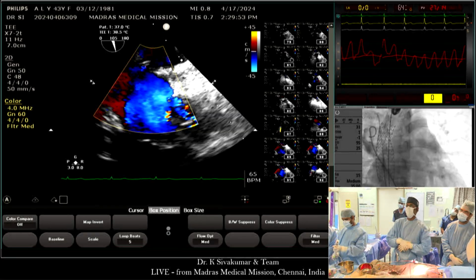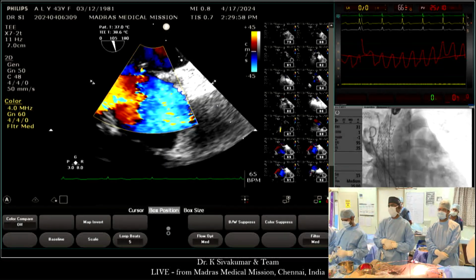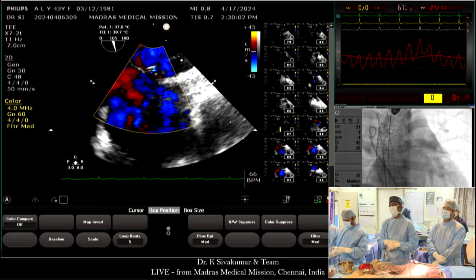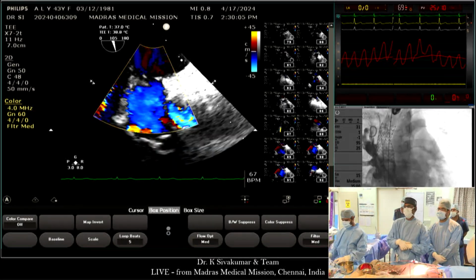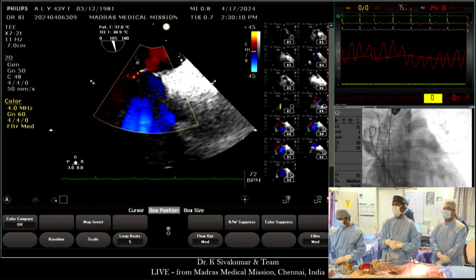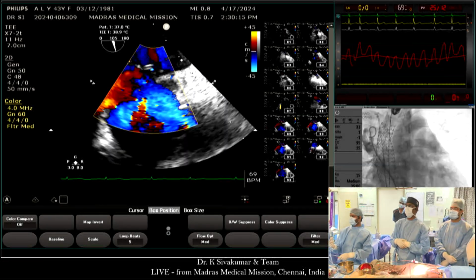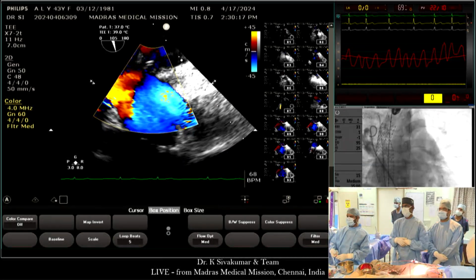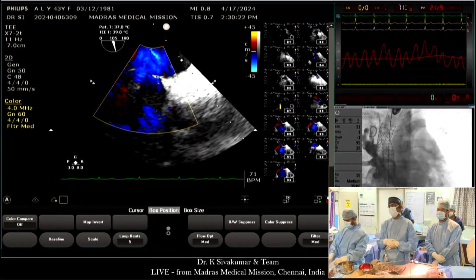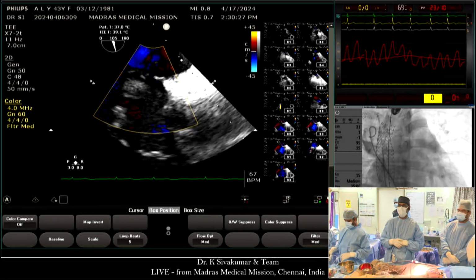All these years, the left ventricle was not getting fully filled because of the pre-tricuspid shunt, and suddenly now a reasonably elderly person is getting the full cardiac output going in. Sivakumar, make sure to put this patient on some diuretics and afterload reduction. We will do that. But 16 is not very alarming, because this patient is on positive pressure ventilation now. Once I take her off the ventilator, there will probably be another 2 or 3 millimeters of reduction. Can you show the stent part nicely?